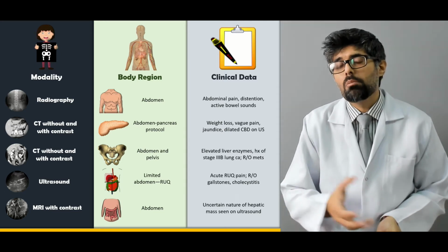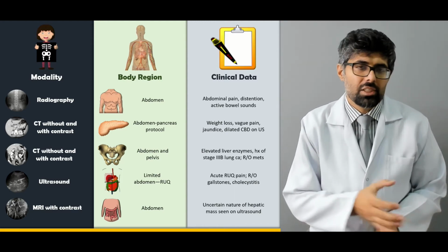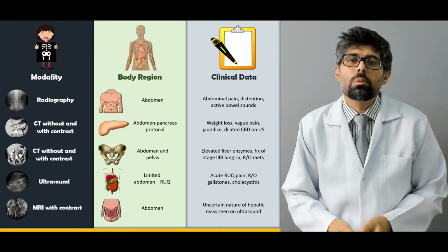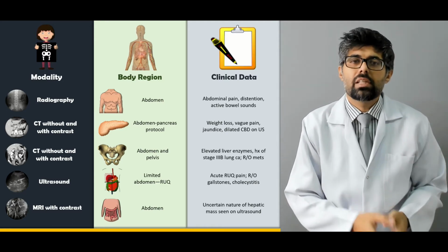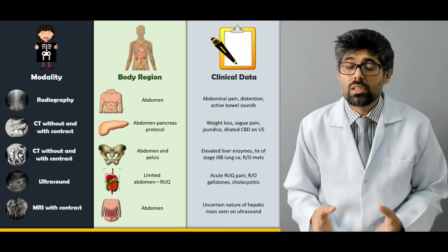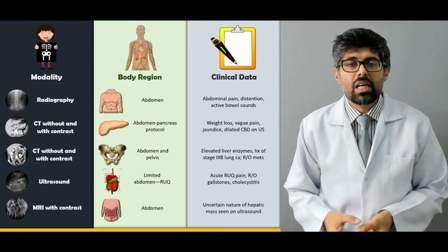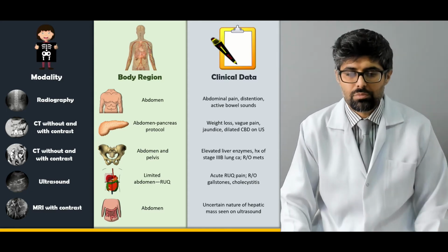At this point, I must also indicate that we also perform PET scan, that is positron emission tomography, in order to stage any cancer in the abdomen and to evaluate the treatment for that cancer. How is that treatment progressing? Is it reducing the mass of the cancer, or is it not? Do we need to change it? PET scan is usually reserved for oncological purposes.